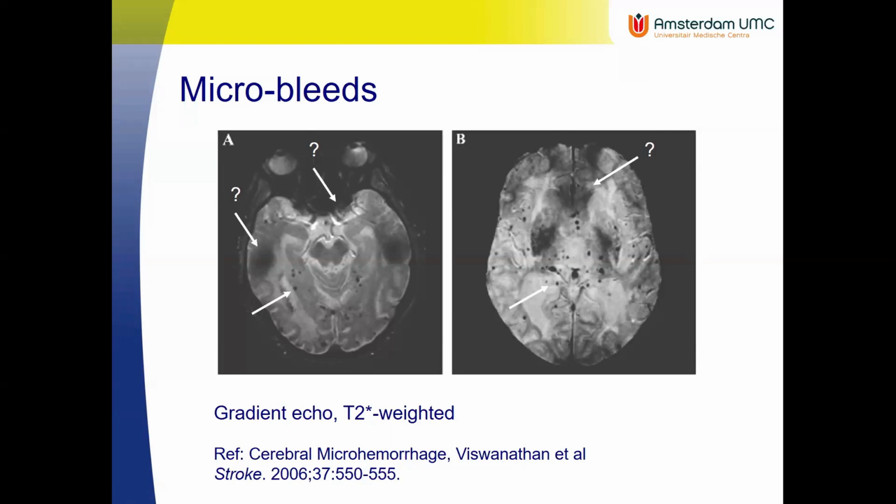It's a very similar signal drop to the sternal wire we showed in the first slide. But now it's very localized. There's no bits and pieces of wire there. There's no sort of metal, I would say. But in case of a microbleed, what would be the source of the perturbation of the local field? What could that be?